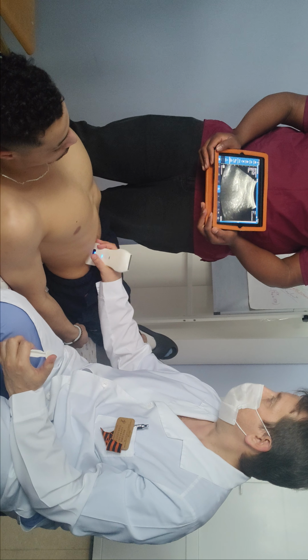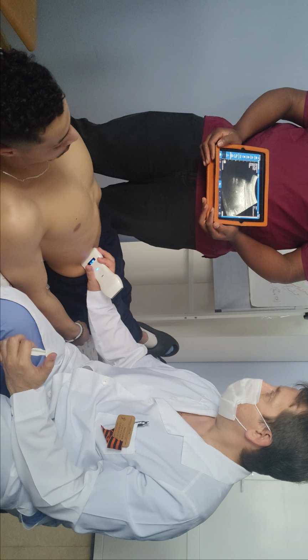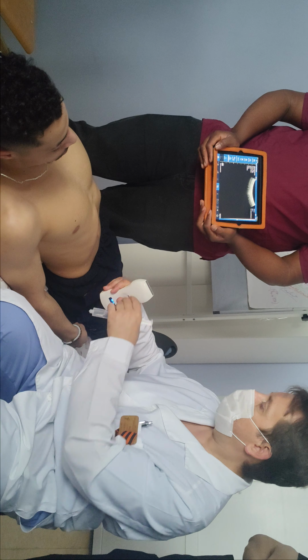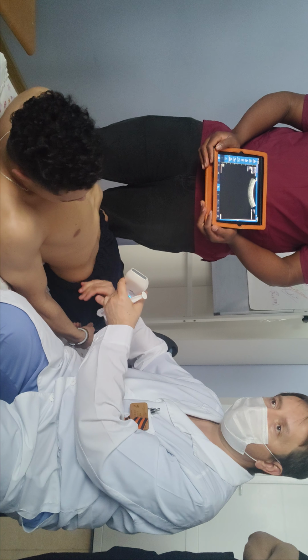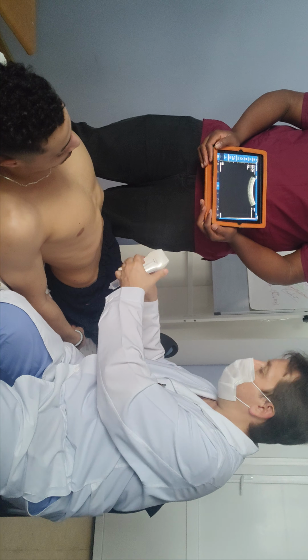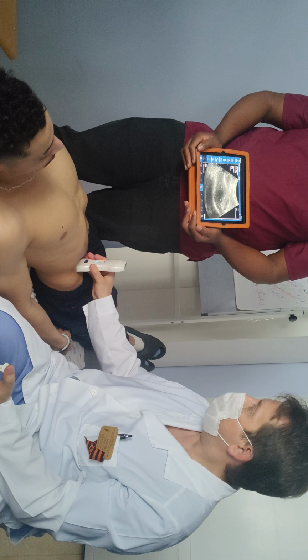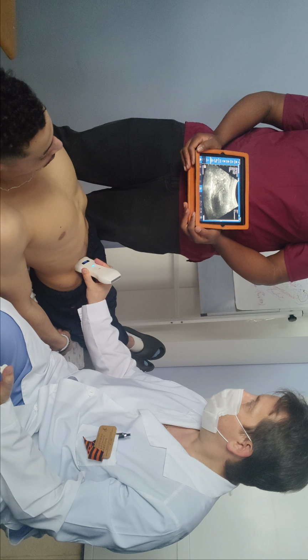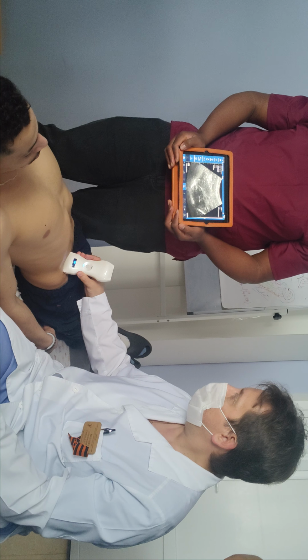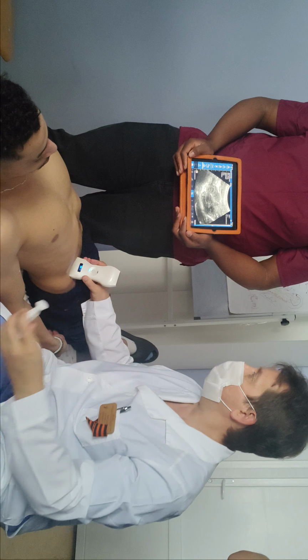Next, we will go here. Try to find some positions here. Actually, the same liquid we have not. After we transfer to the osseous part of the pelvis, just here, it is our orientation. We are looking just here, the part of the what? The part of the peritoneum. That white, it is a peritoneum. It is that pocket which we are looking for.